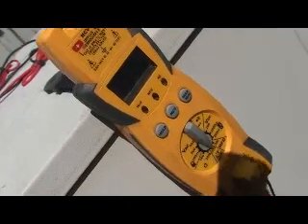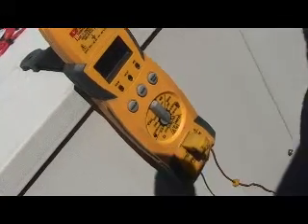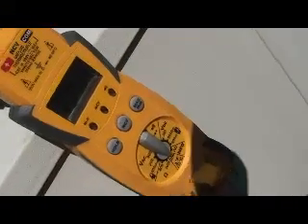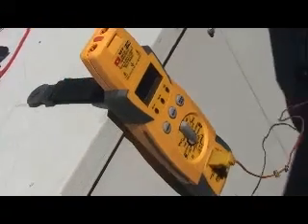It's really good too. If you have a gun to take the temperature with, it works better. But this works also. It's 105 degrees, which is normal temperature for a motor. So, all right, we got our motor checked. Let's keep going through our list here. So that was temperature of the motor from the center.